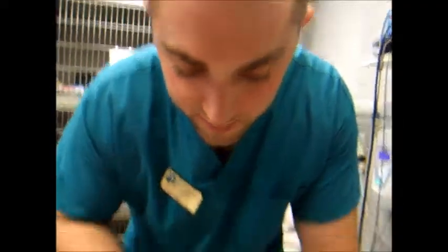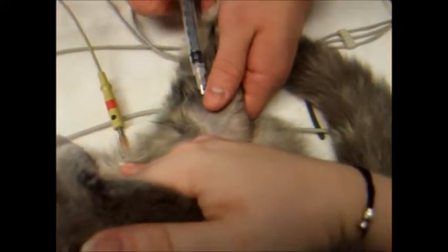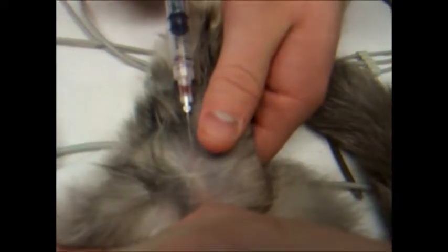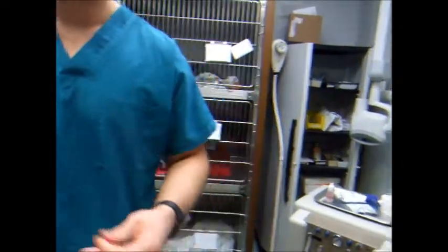I draw from the saphenous vein. I have a cat here. There's our blood. Alright, now we're going to do cephalic.